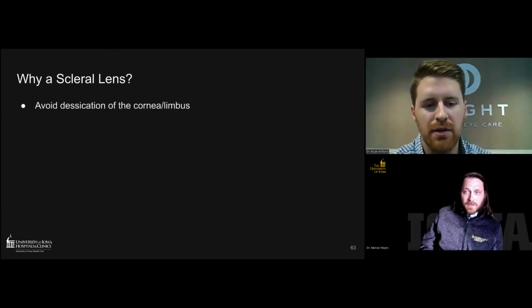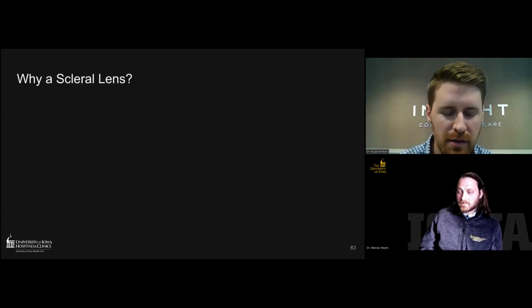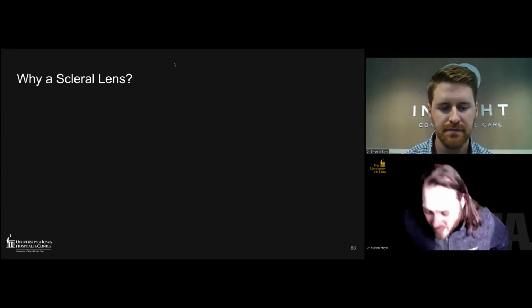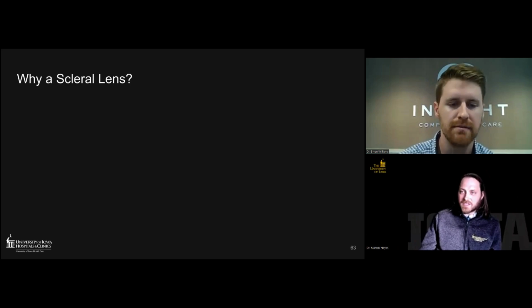So I wanted to ask quickly about that one before. If you're coming in with high clearance in that right eye, I guess like you were saying before, that's just something you kind of live with if it ends up coming down and resting gently on a PK patient like that, not something you're trying to tweak to get a little bit higher clearance, a little bit lower. No, so I would tweak it to get a higher clearance. But just on the initial dispense, she was someone who just needed it kind of like right now. Yeah. So we dispensed it like that anyway, and I don't have a picture, but we did actually increase the clearance a bit. Okay. Tune up the fit, make sure everything looks good.